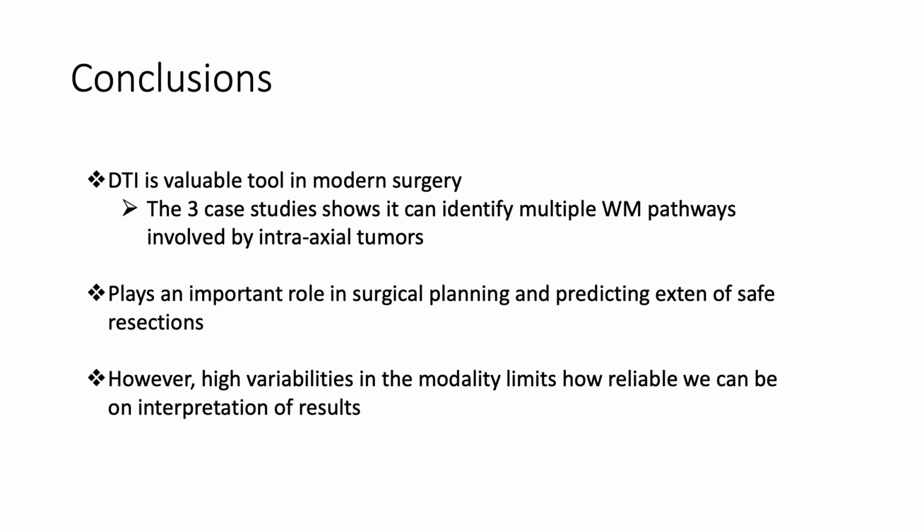In conclusion, this paper reflects how diffusion-tensor imaging, or DTI, is a valuable tool in modern neurosurgery, as it can identify multiple white matter pathways involved by intraaxial tumors. The three case studies show it can identify multiple white matter paths in both males and females and of different extent of tumor.